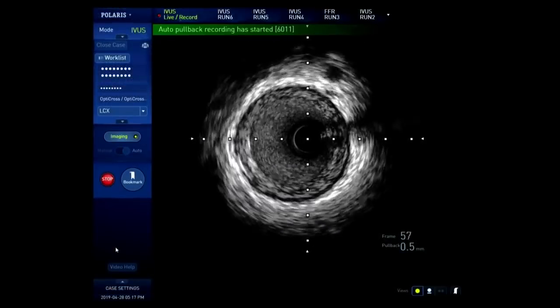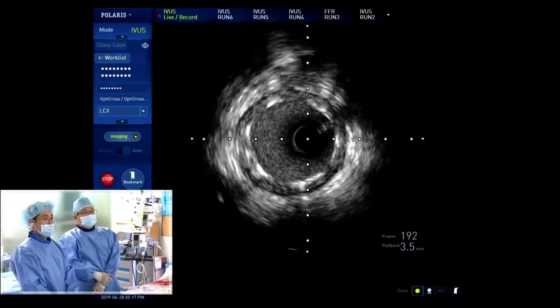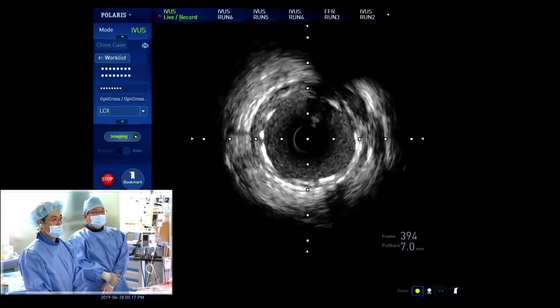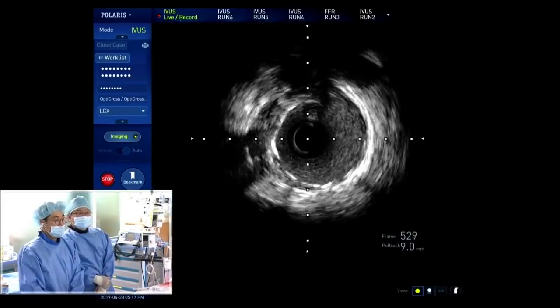3.25 I implanted, and I applied high pressure using the 3.25 high-pressure balloon. I did not touch the distal part, but the distal stent landing expansion is good. I think it's almost perfect, right? Then the 3.5, I applied high pressure here, more than 24.